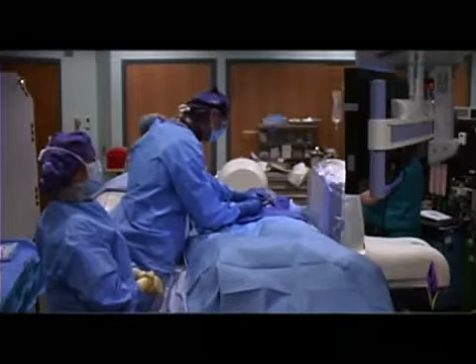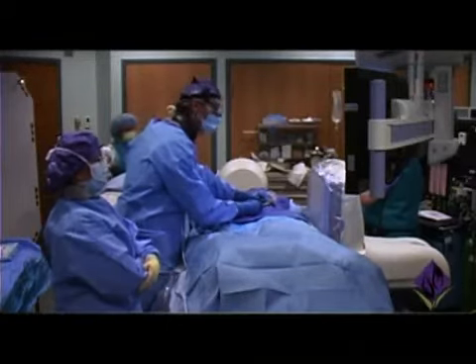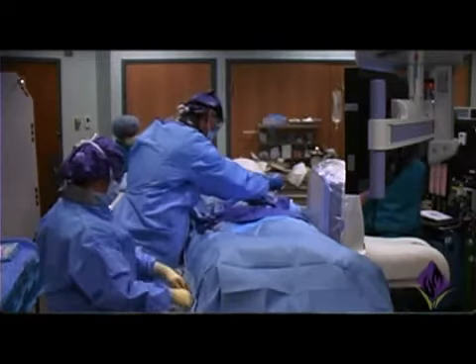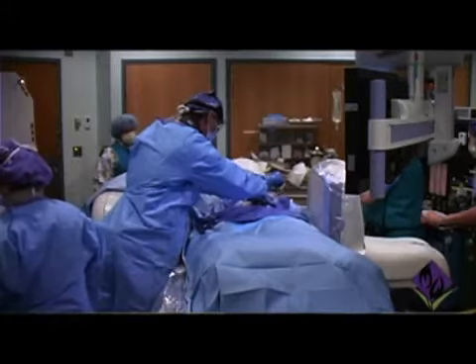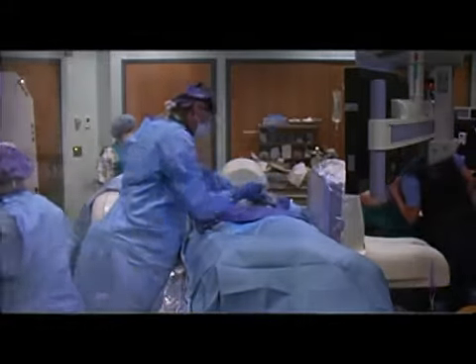We're now going to advance further into the vertebral body. The angle looks terrific for placement of the balloons and curetting and all that. Okay, let's go AP. On the lateral view, this looks like terrific positioning. And in the AP view, it looks terrific.